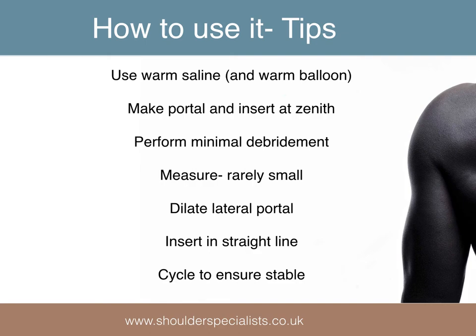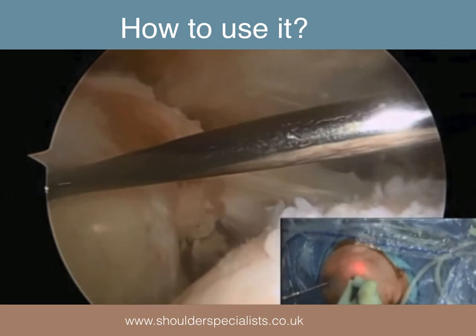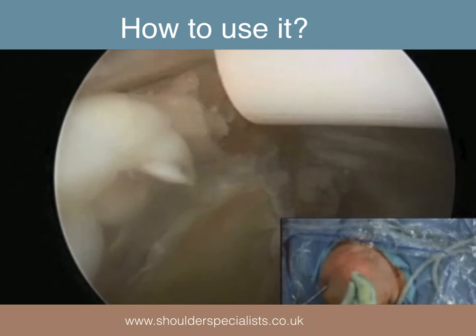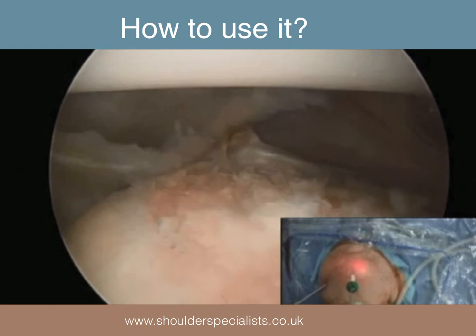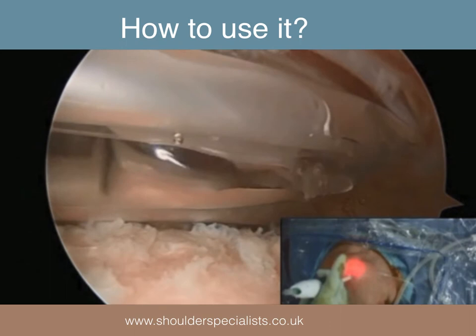It is advisable to cycle the arm a few times whilst observing the inflated balloon to ensure stability. This video of a right shoulder viewed from posterior shows the debridement mainly superior, measurement taken with the skin pinched, smooth insertion of the balloon without any torque on the inserter, placement at the superior most point of the glenoid, withdrawal of the inserter, and inflation.